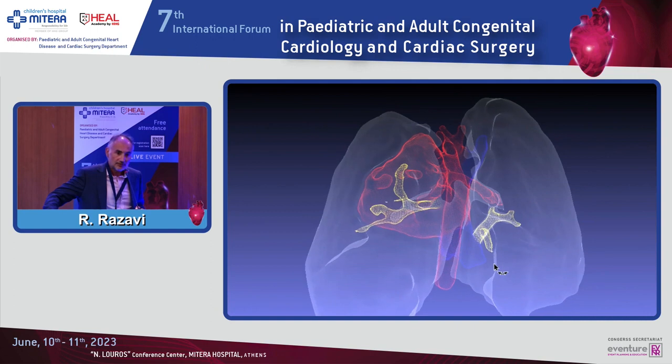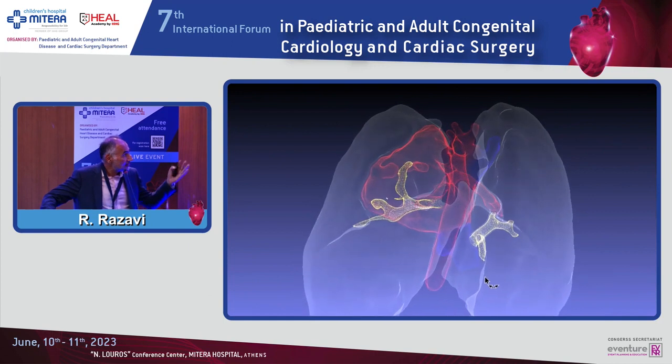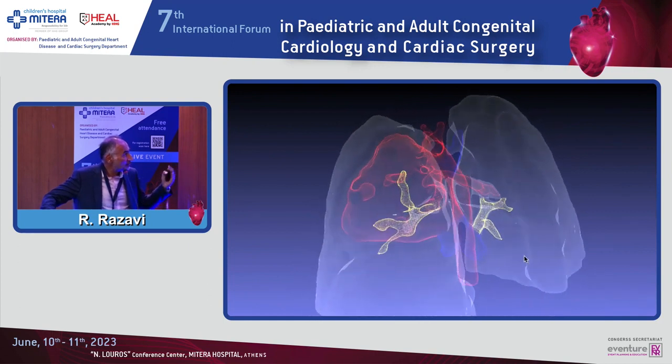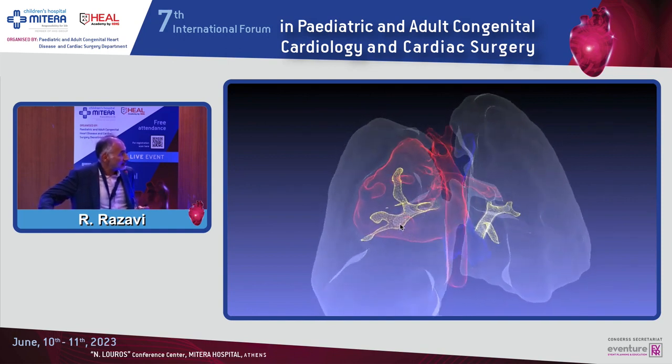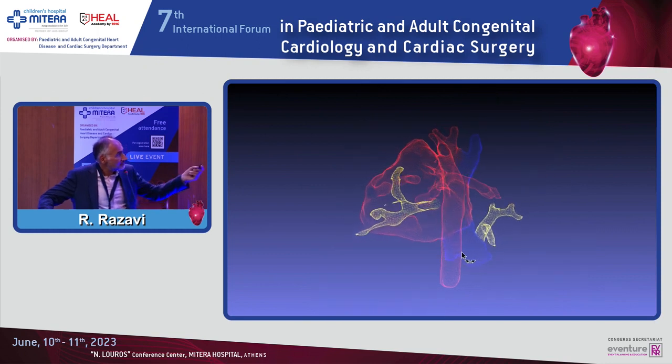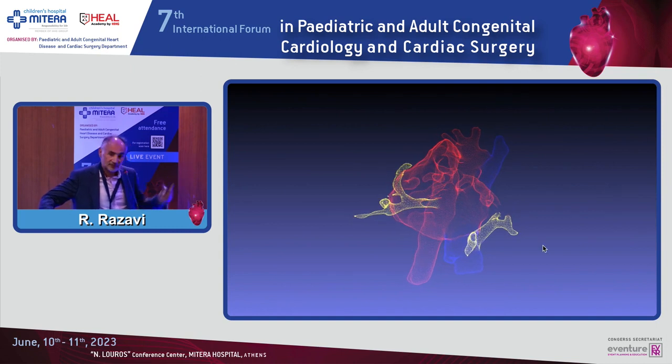How about pulmonary venous abnormalities? Again, we're looking from the back of the heart here. The lungs, you can see the descending aorta, and the pulmonary veins are shown in yellow. As we click the lungs out of the way, you will see that the right-sided pulmonary veins are coming into the IVC-RA junction, and the left-sided ones are draining normally. So, right anomalous pulmonary venous drainage. Here, in a fetus, in that tiny heart, suddenly we're getting the anatomical structures very clear, so that even I can understand. Of course, our fetal cardiologists will be able to do this, but as a simple cardiologist, we can suddenly see what's going on as well.